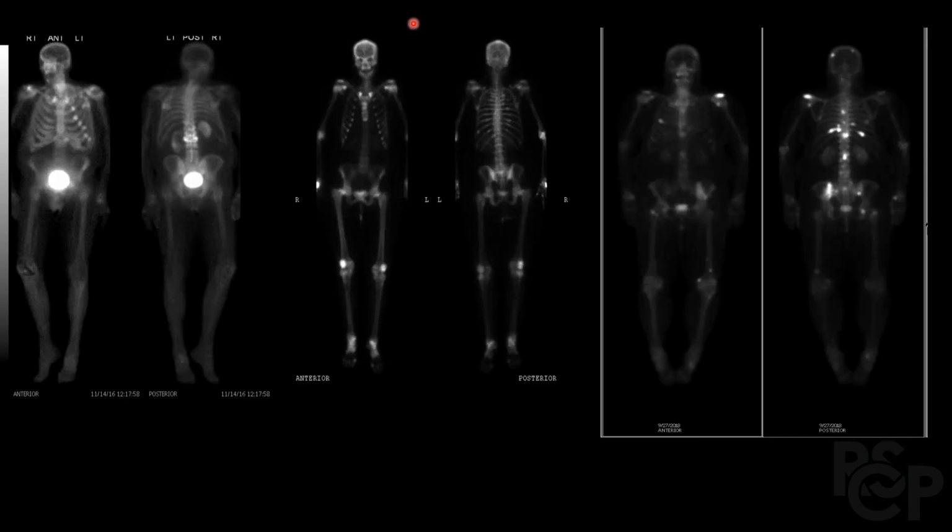We're just going to quickly summarize what we discussed in the video. Bone scans usually identify three most common things: metabolic disease, metastatic disease, or trauma, with the various signs we discussed. Metabolic disease shows diffuse uptake in the skull, the sternal tie, costochondral beading, and a very symmetrical pattern of increased uptake in the joints area. Compare that to metastatic disease, which has very focal areas of increased uptake scattered throughout, usually not a symmetrical pattern, and to trauma, which we can note in the ribs over here, with a very diagonal pattern.